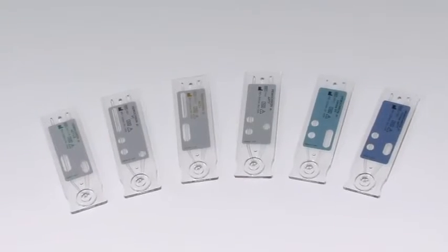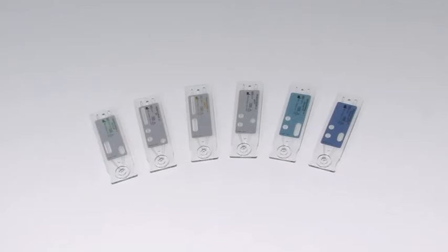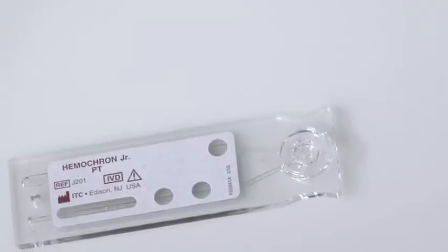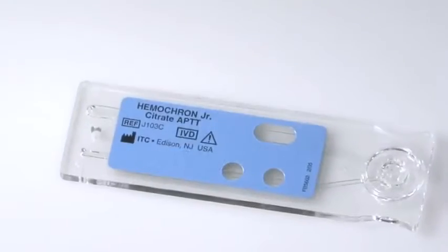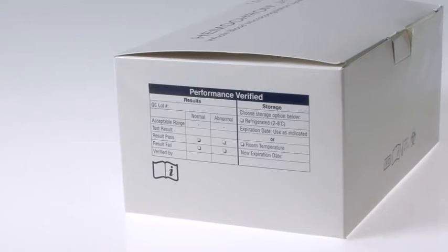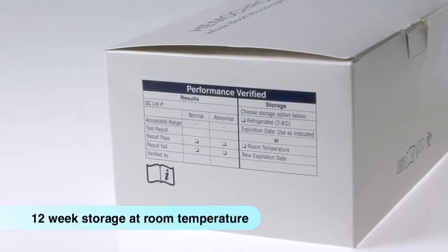Elite uses Hemocron Junior low blood volume micro-sample testing cuvettes. The broad testing array includes fresh whole blood tests for ACT+, ACT low range, PT, and APTT, as well as PT and APTT tests for citrated whole blood. Hemocron Junior cuvettes are packaged individually and can be stored for up to 12 weeks at room temperature, making them easy to store on the floors.